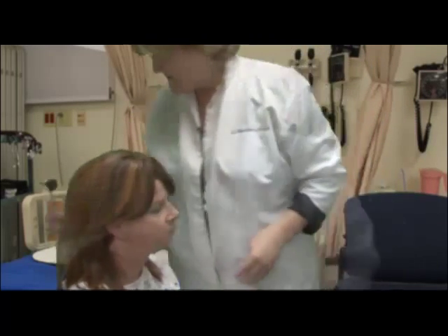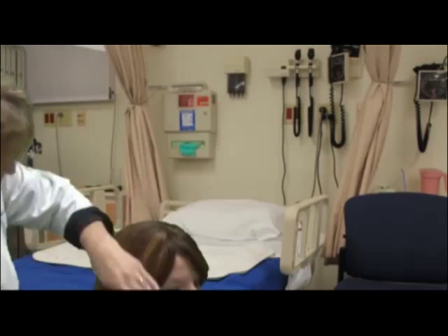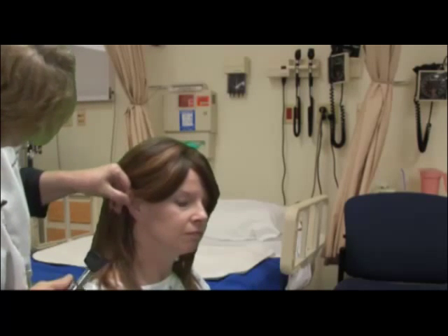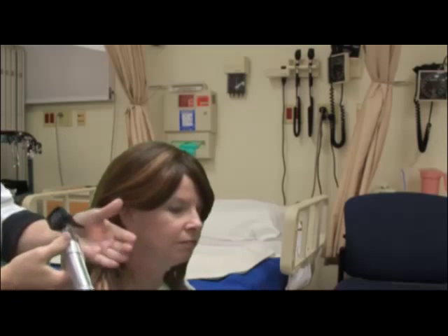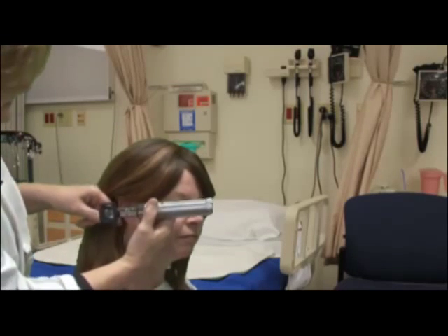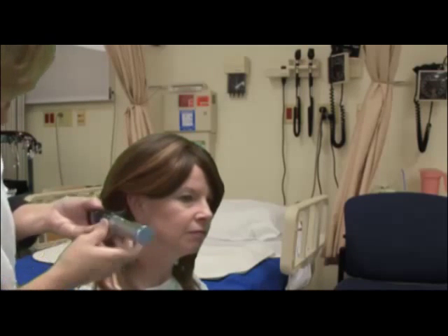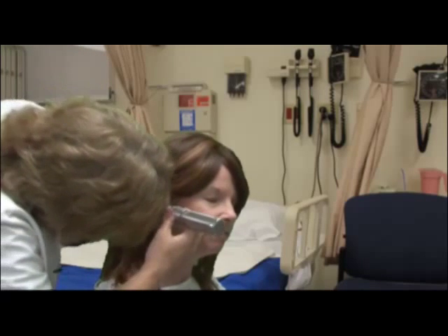What I'm going to do is get on the other side of her, and I'm going to look in her ear. And since she's an adult, I'm going to pull her external ear back and up. Okay, I hold my otoscope that I'm turning on like this so I can steady myself, but you might see some people practice like that. So I'm going up and in. I'm going to check your ear, gently put it in.